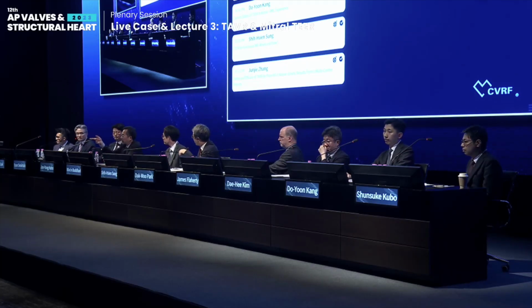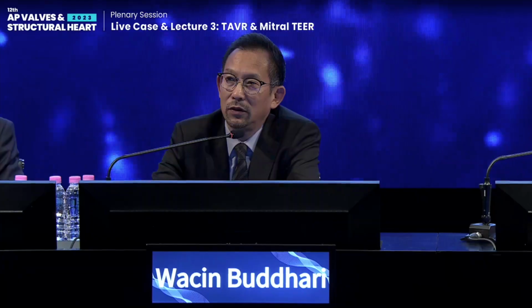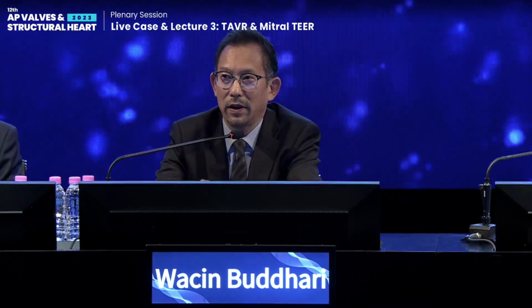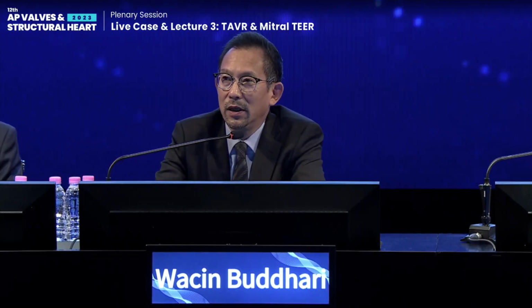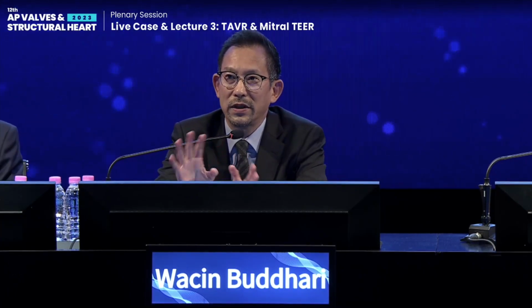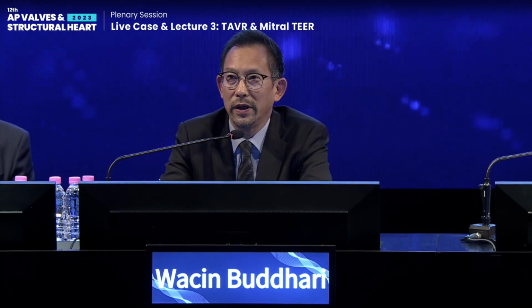Okay. One question for Dr. Zhang. What is the reason the VitaFlow valve seems to work better than the other self-expandable valve for AR, for pure AR? Is it because of the radial strength or the shape of the valve? And what percentage of oversizing do you normally do with the AR?